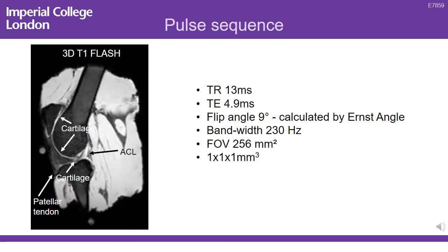Reviewing the literature to learn how to remove a magic angle artifact proved useful in optimizing proton density and T1 weighted 3D pulse sequences. For MADI, we actually selected a T1 FLASH sequence as it provided the greatest magic angle effect in the fastest time. And this was an important consideration, bearing in mind we would need to repeat the sequence multiple times in multiple directions.